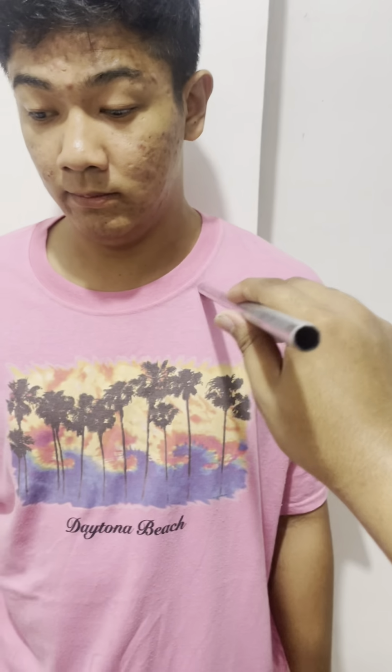Projection is AP projection. Perpendicular to the midshaft of clavicle. This projection shows frontal image of clavicle. And yan po sa mid-shaft of clavicle.